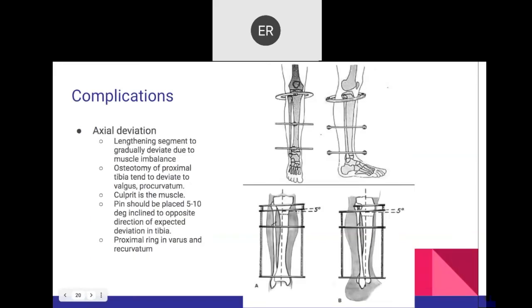Complications with circular fixators can largely be prevented with careful placement. The true complication is when you have to abort treatment and change plans. Looking at the picture, the proximal ring is slightly posteriorly declined and placed just at the superior border of the tibial tuberosity to prevent anterior translation of the tibia during lengthening. Placing it slightly below the tibial tuberosity makes it easier and can prevent that additional translation.